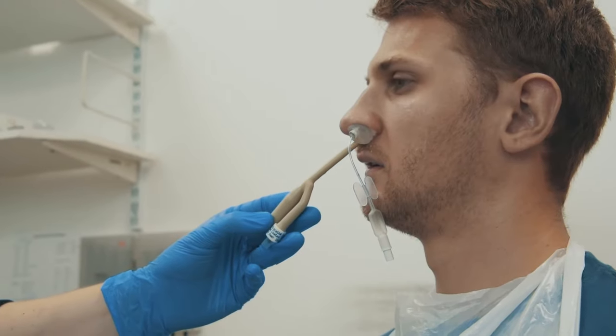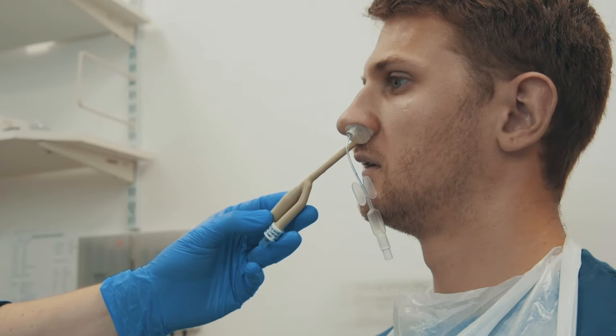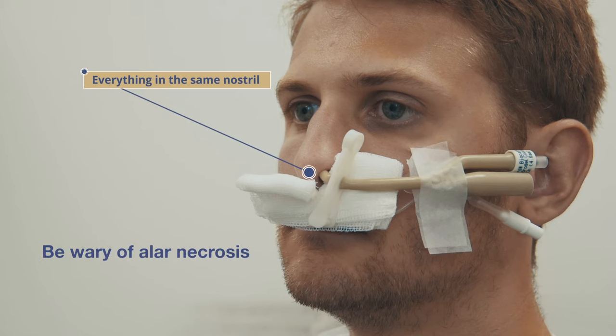Keep hold of the catheter and ensure the patient keeps their head still or rested against the bed. Then insert the rapid rhino alongside the catheter using the same technique as for anterior packing. Finally, use an umbilical clip to clamp the catheter, preventing the balloon from falling posterior inferiorly.